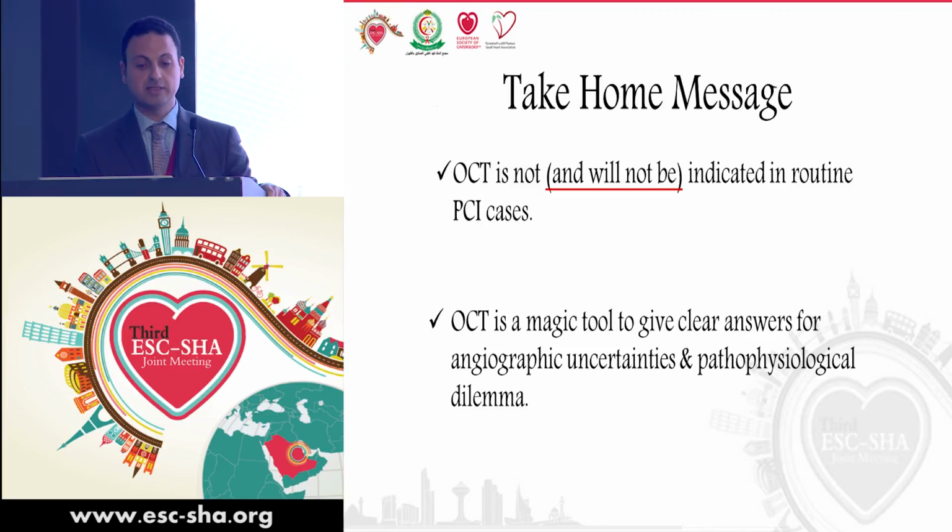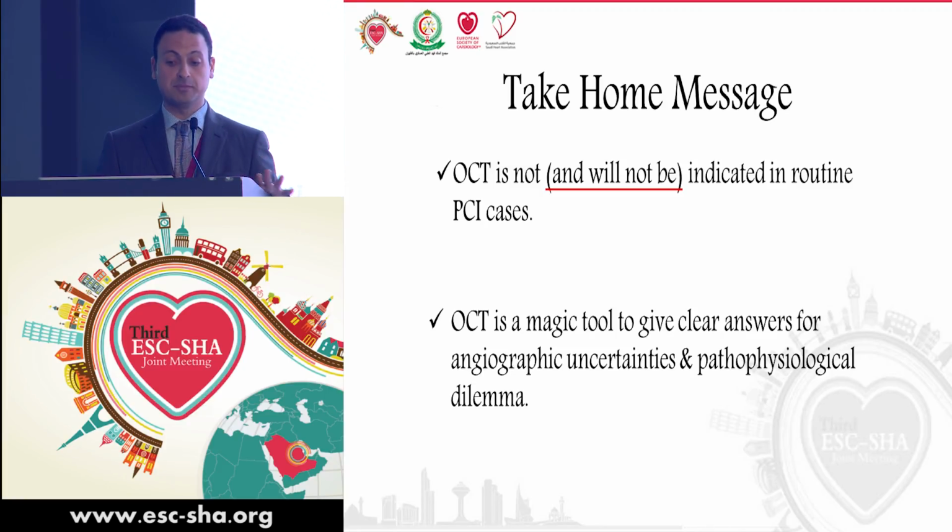My take-home message is OCT is not, and I guess it will not be, indicated in routine PCI cases, yet OCT is a magic tool to give clear answers for angiographic uncertainties and pathophysiological dilemma.